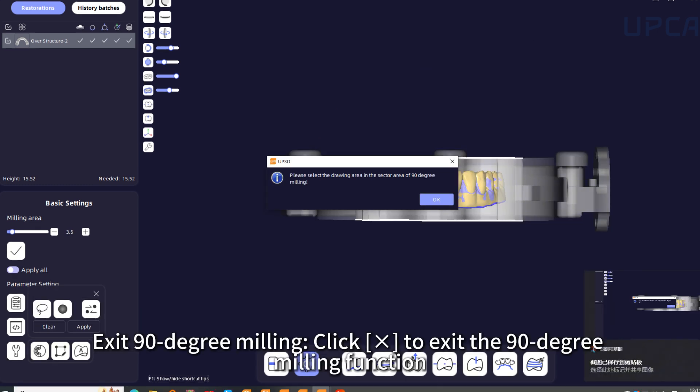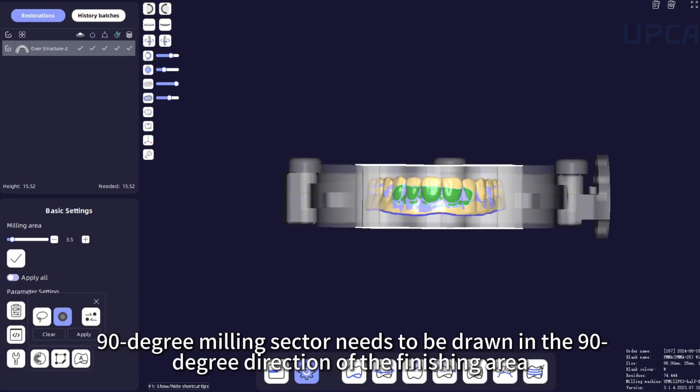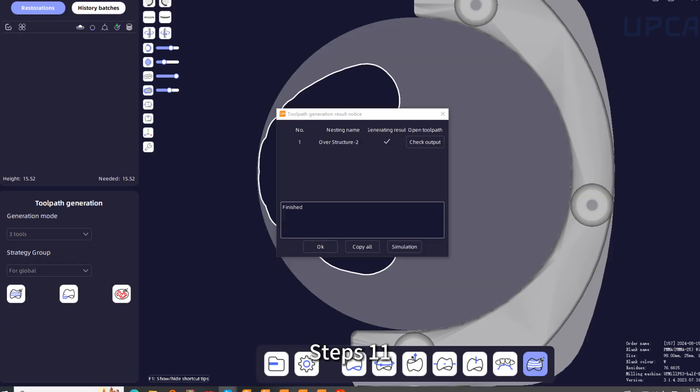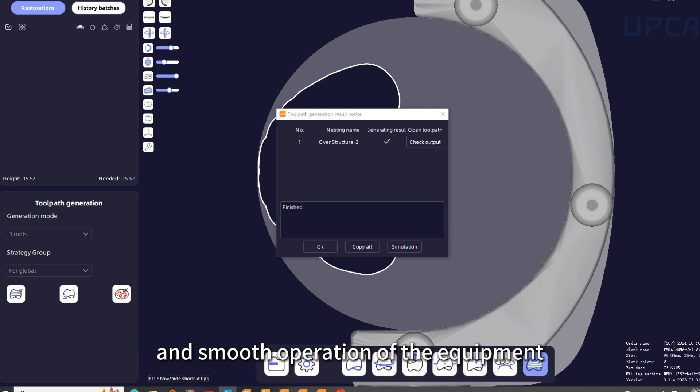Step 9: Exit 90-degree milling — click X to exit the 90-degree milling function. Step 10: The 90-degree milling sector needs to be drawn in the 90-degree direction of the finishing area. Use the Lasso tool or Ball tool to select the processing area, and then click Apply. 90-degree milling setup is complete. Step 11: UPCAM will automatically generate NC files to ensure accurate transmission of milling data and smooth operation of the equipment.